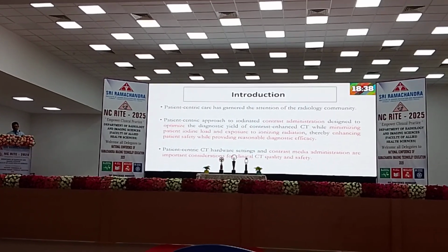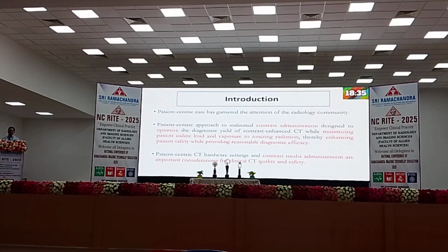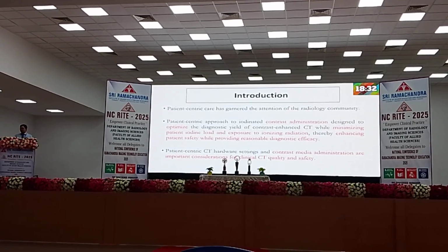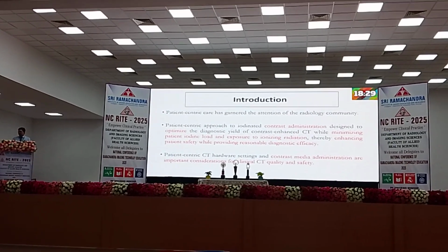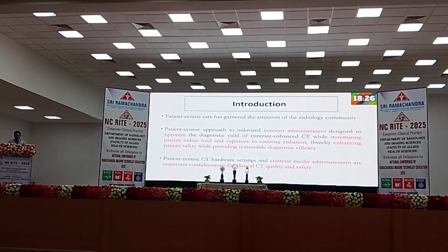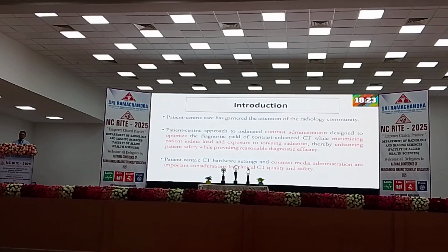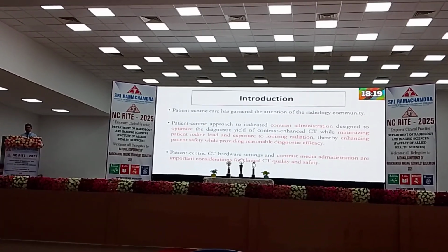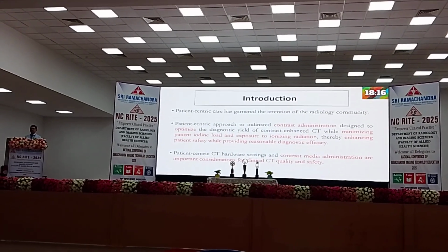So all of you are very well aware of contrast when we administer it. Most places do a hand injection, but nowadays, as per my knowledge, every center has at least a single syringe or dual syringe injector, and most places have a dual syringe injector. So if it is a single syringe injector, what are we supposed to do? If it is a dual syringe injector, what are we supposed to do? And whenever you are injecting the contrast, what are the different factors?